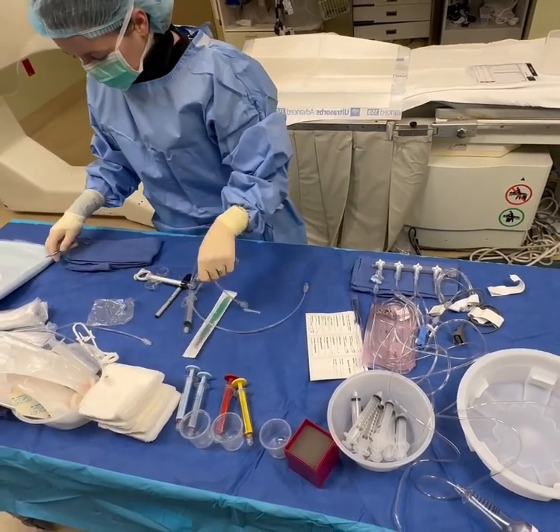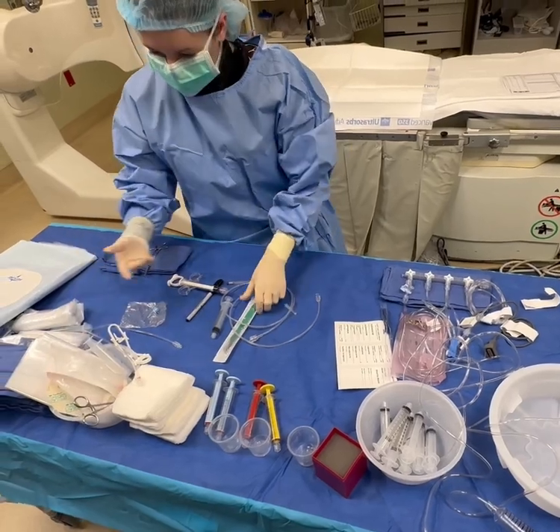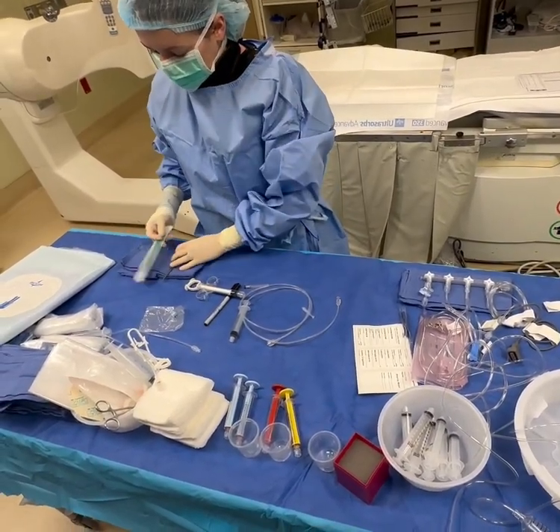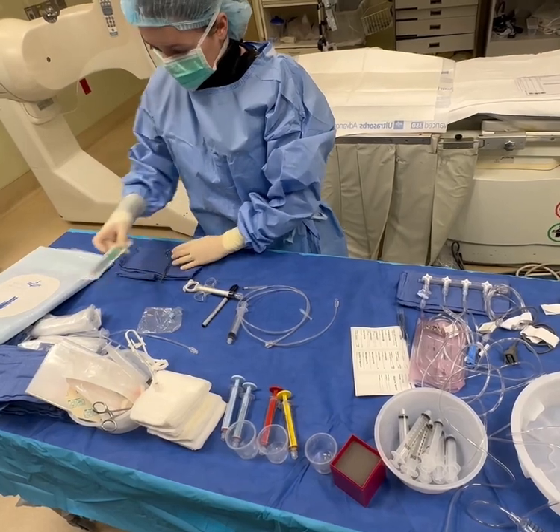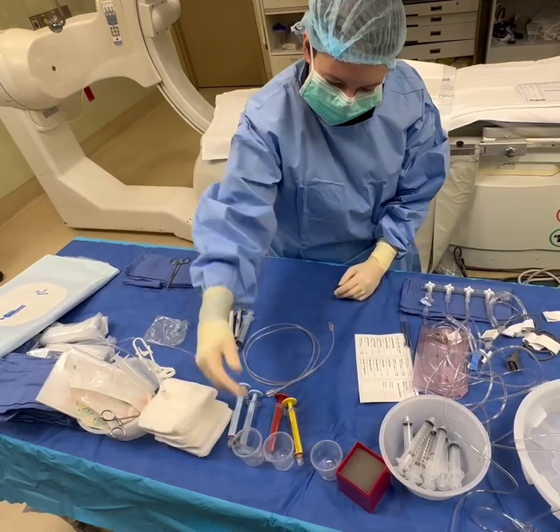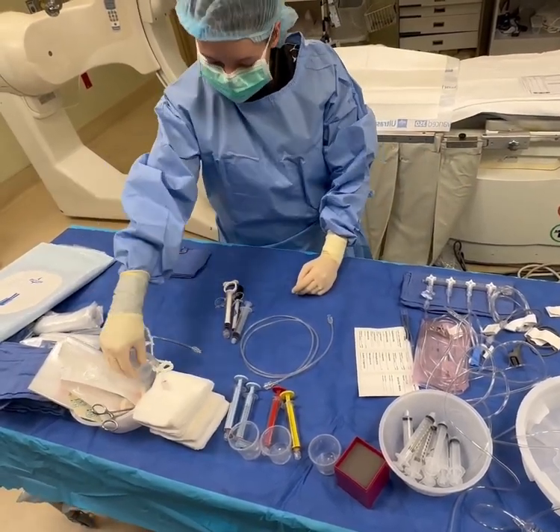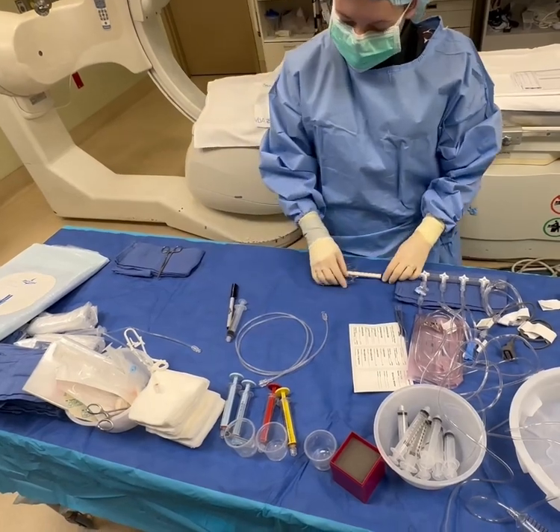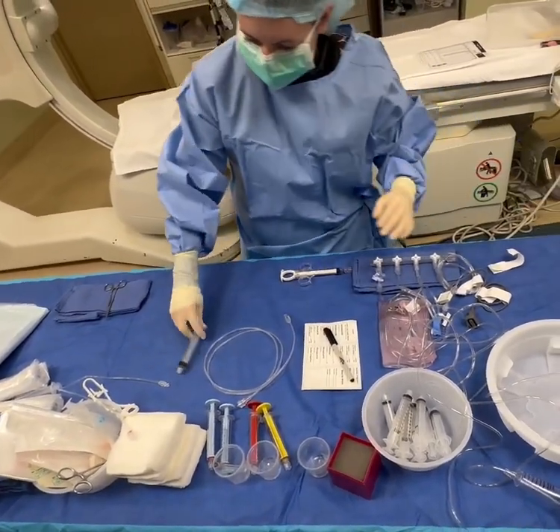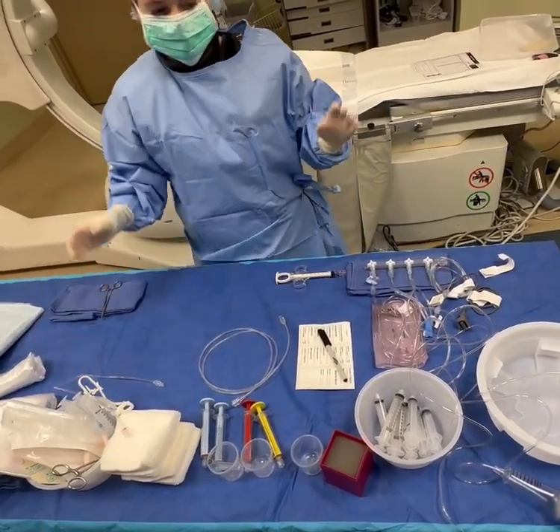Set my hemostats up. Usually the doctor only prefers one. They don't really prefer the curved tip. You can keep it if you want to or not. The blade, that's doctor preference too. Either set it out or don't. Doesn't matter. I know that most doctors don't like it. And then I usually dump my lidocaine needles and my lidocaine cup. It's just one more reminder for me. This is a dead ender if you need it. And this is your control syringe right here. This is your marker to label your labels correctly. And voila, your table is set. Okay? All right, pause.